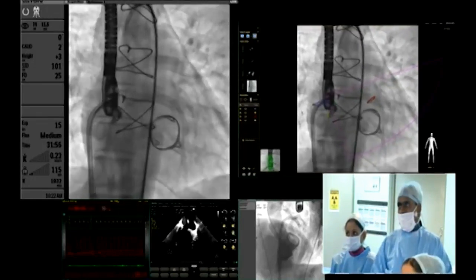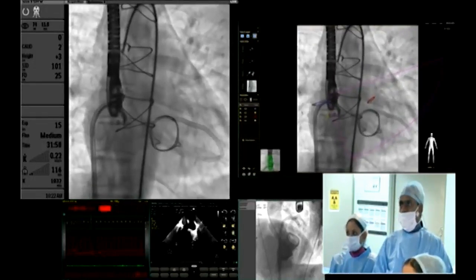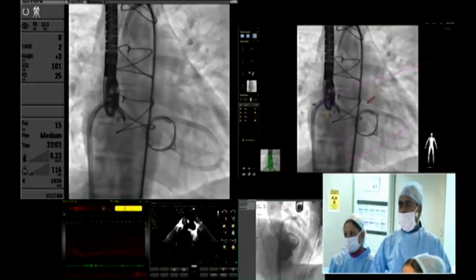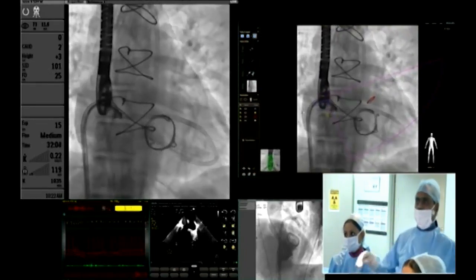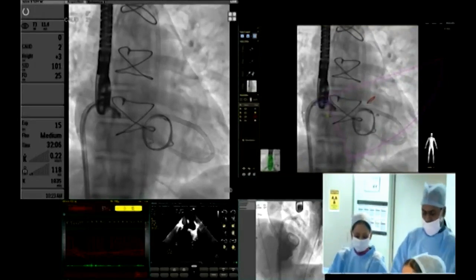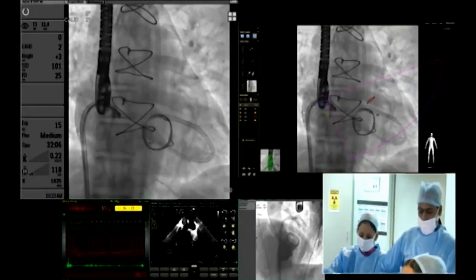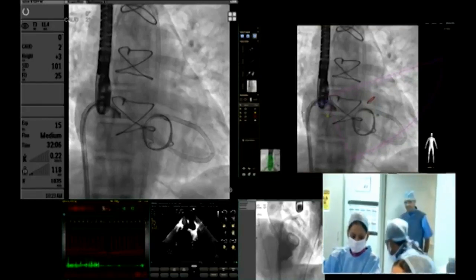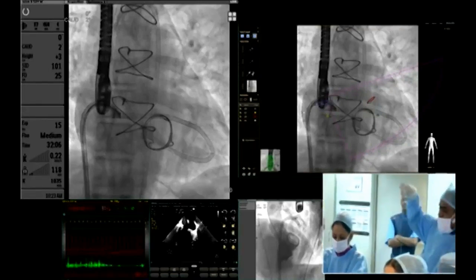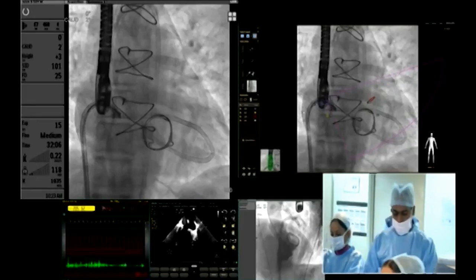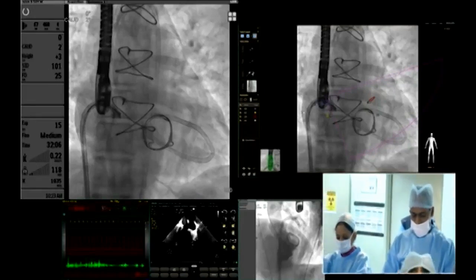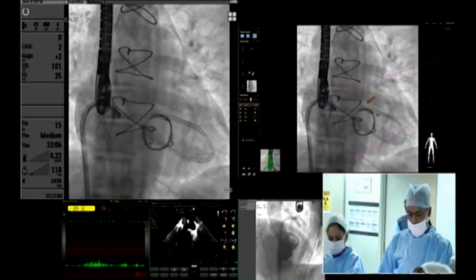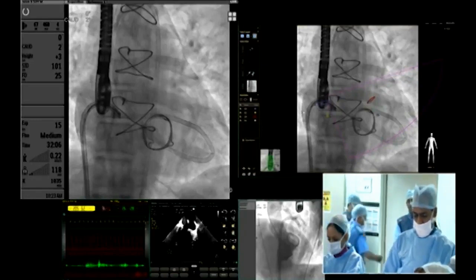First cross this area with a wire — the kink with a wire — and then put in the dilator. We have snared the other end. The dilator won't go without the wire first, but after the wire the dilator can go. There is resistance at that point — I feel there is probably a lot of bend in that area, despite this being a completely braided shuttle sheath, which is usually a very good sheath and does not kink like this.